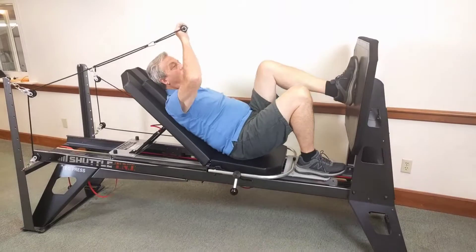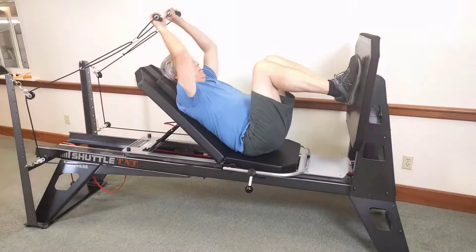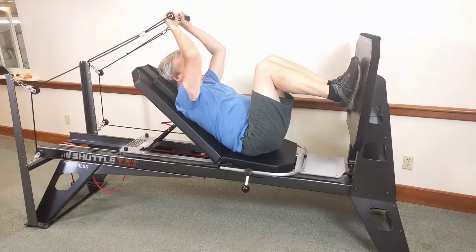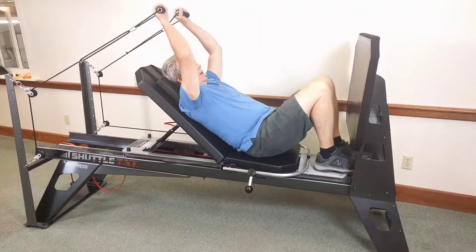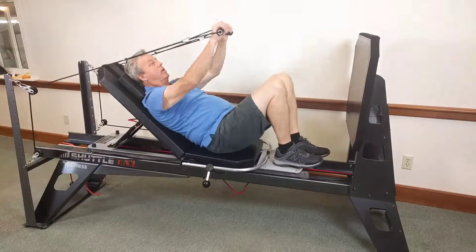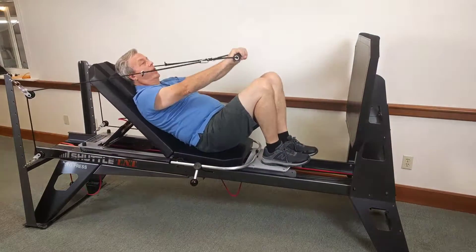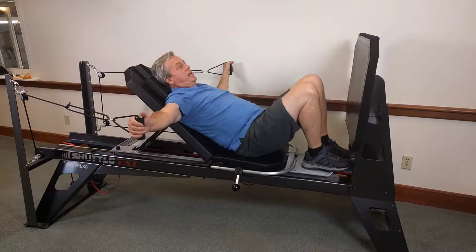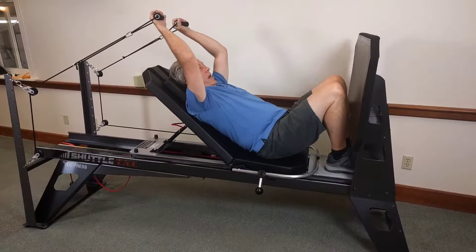Normally I do this with a little bit more load. Right now I only have the six pound cord on, so it's very easy to do with my arms alone. But with higher load, you would want to accompany it with your legs as well. So we'll go out to the side and back up again.